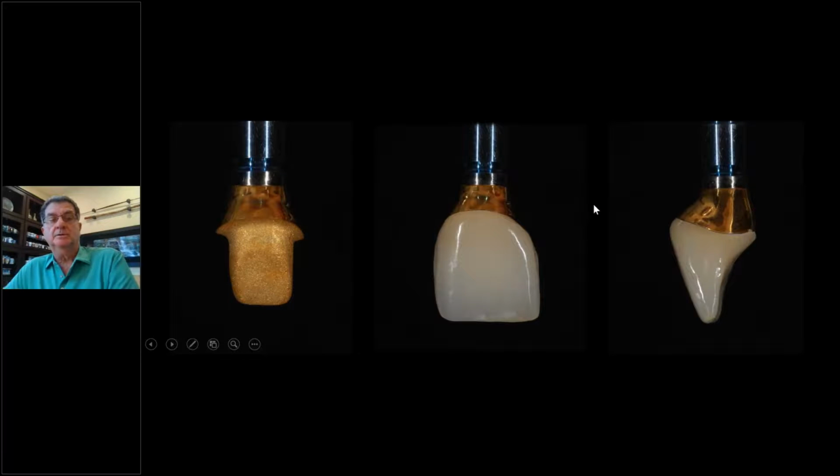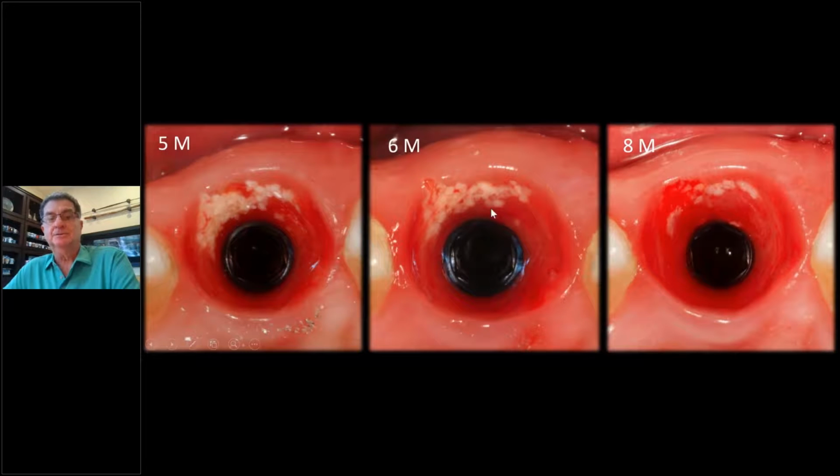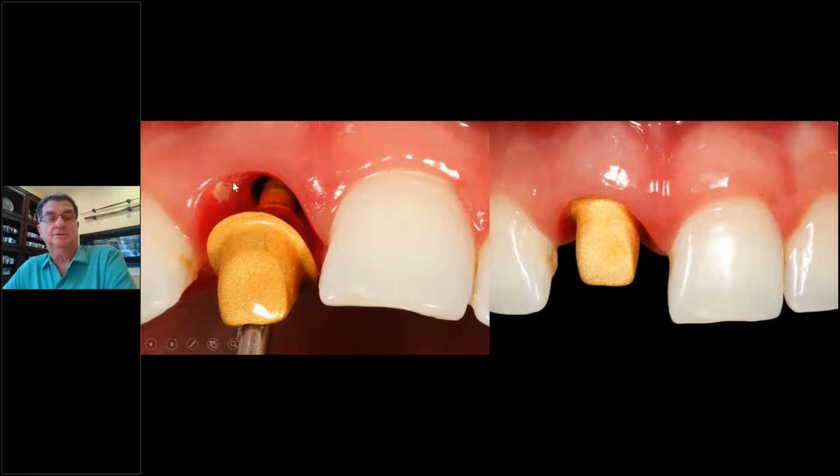He made again, the cementable one in this case, but he made it customized. We gold plated. This is ceramic metal that's gold plated. That's what we like to do for color. And here it is at 5 months, 6 months, and 8 months. Now we're ready to finish the case with this. Notice the particles are still working their way out. And we cemented this on. We cemented this in and tightened it down, knowing that some of those particles were still slowly working their way out the sulcus.